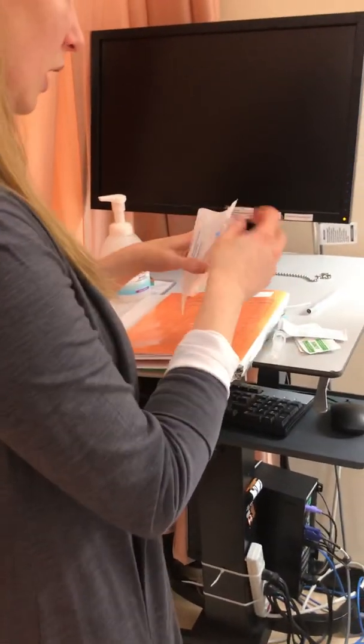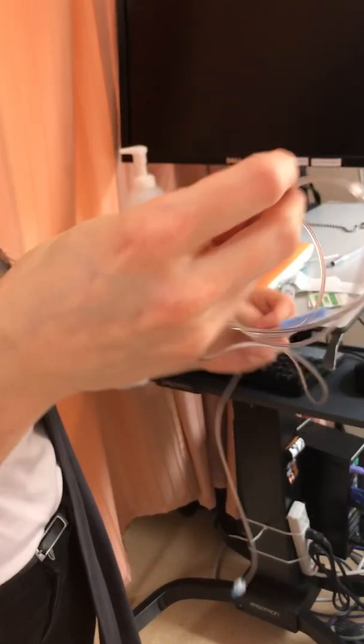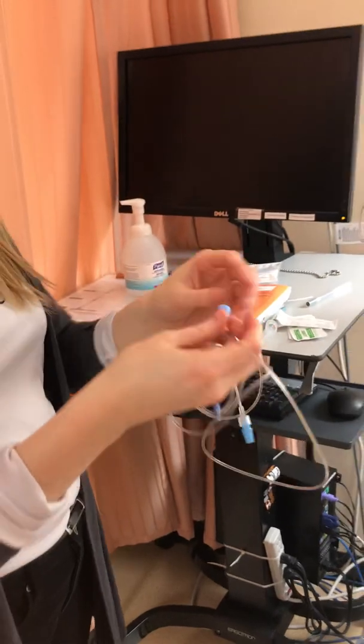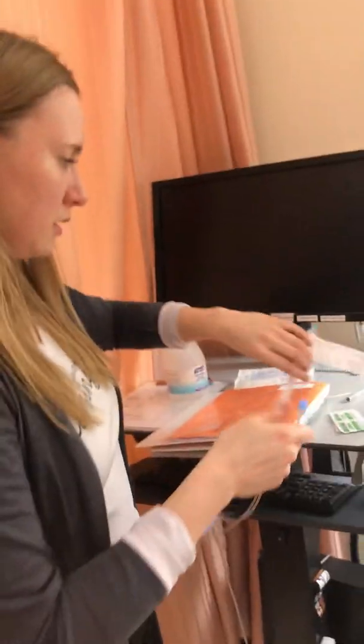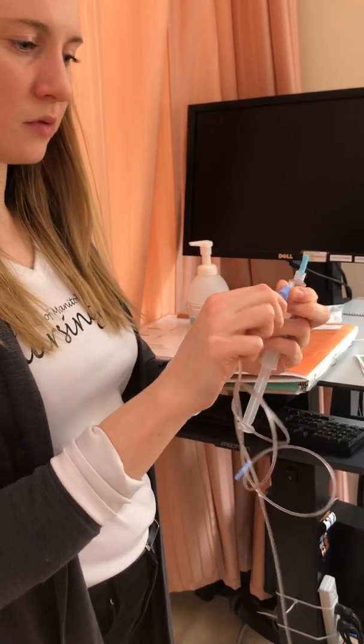Okay, so at this time, I will start to prepare this. This is my CIVA. This is my pump. So I will be attaching these two, just maintaining sterility.